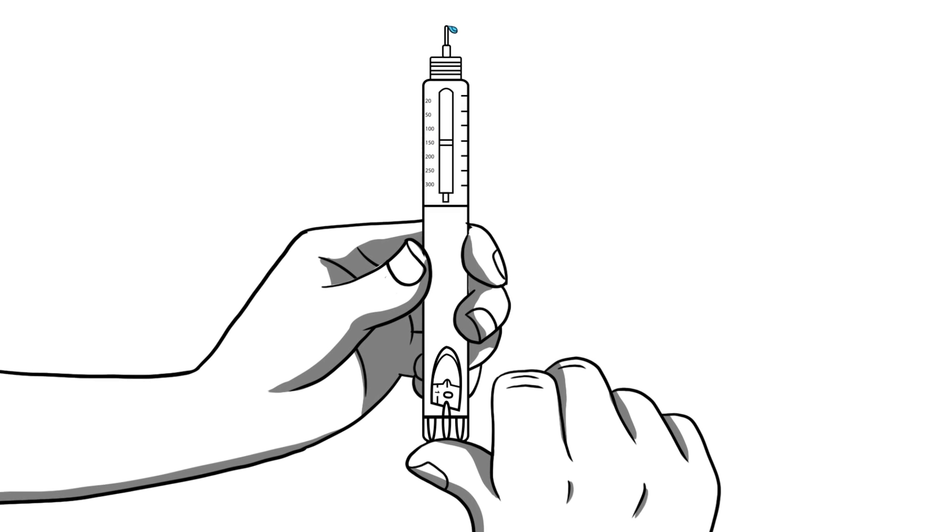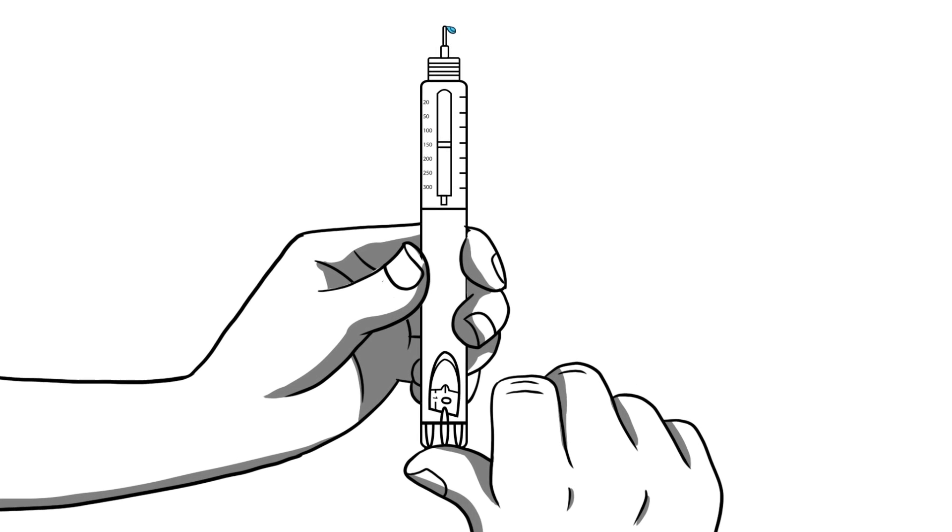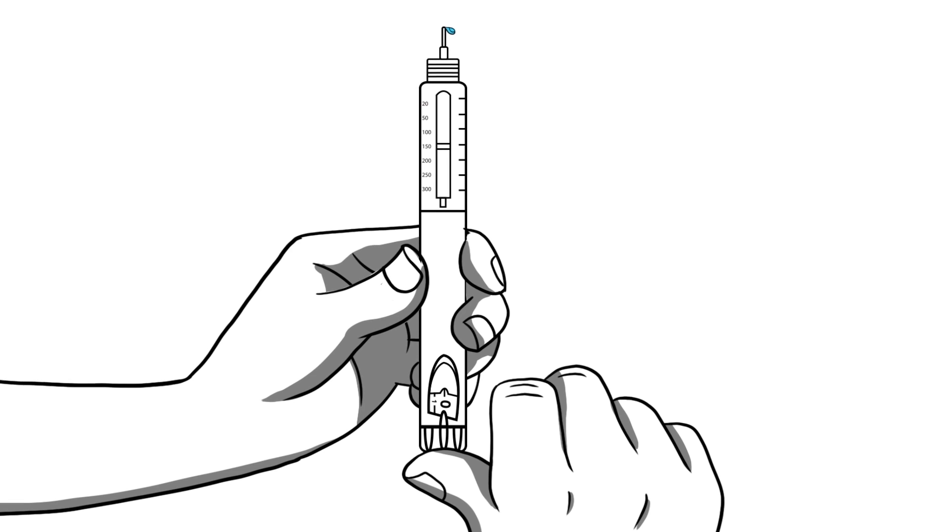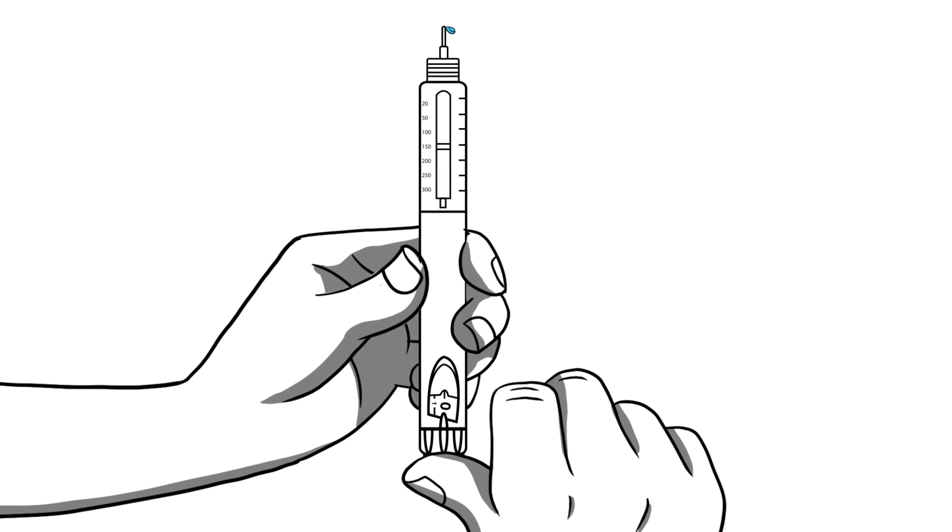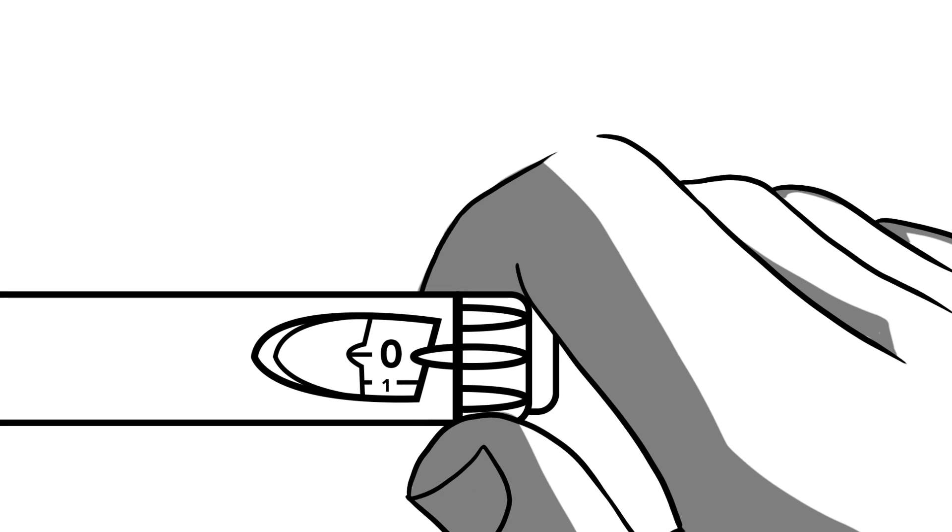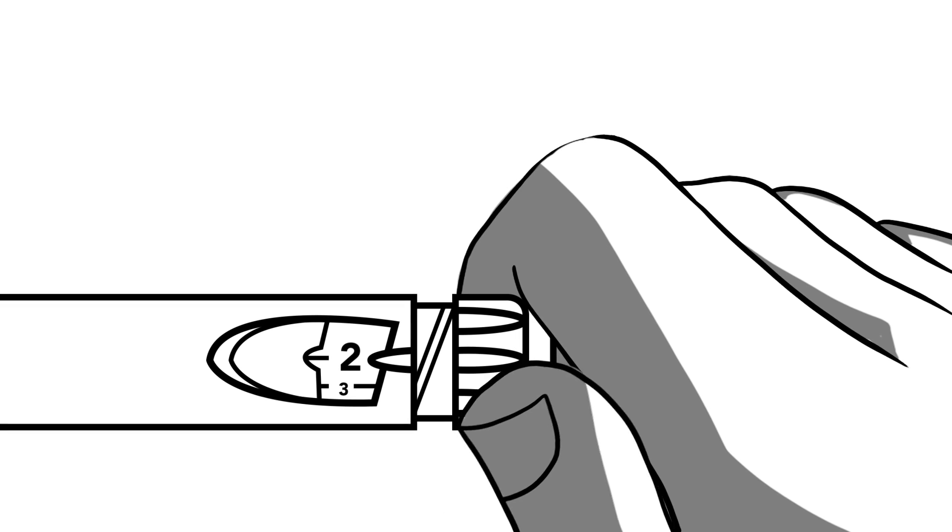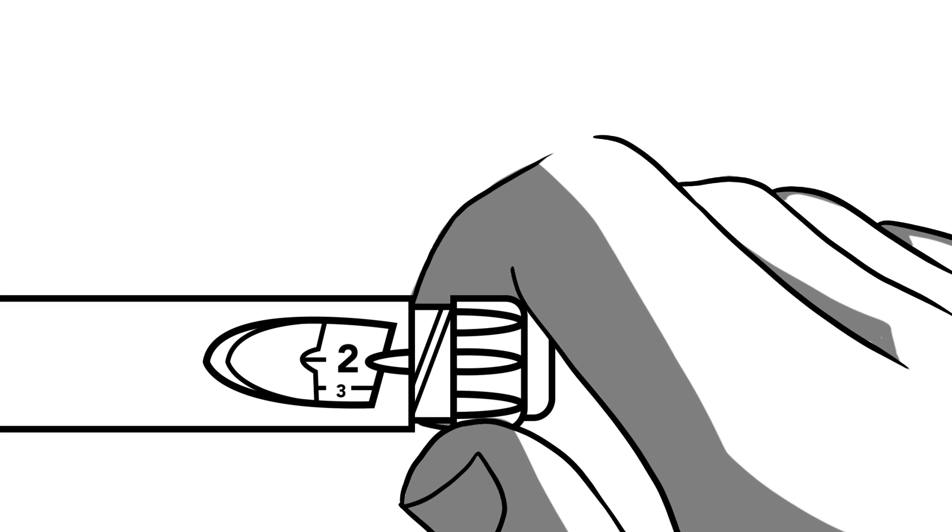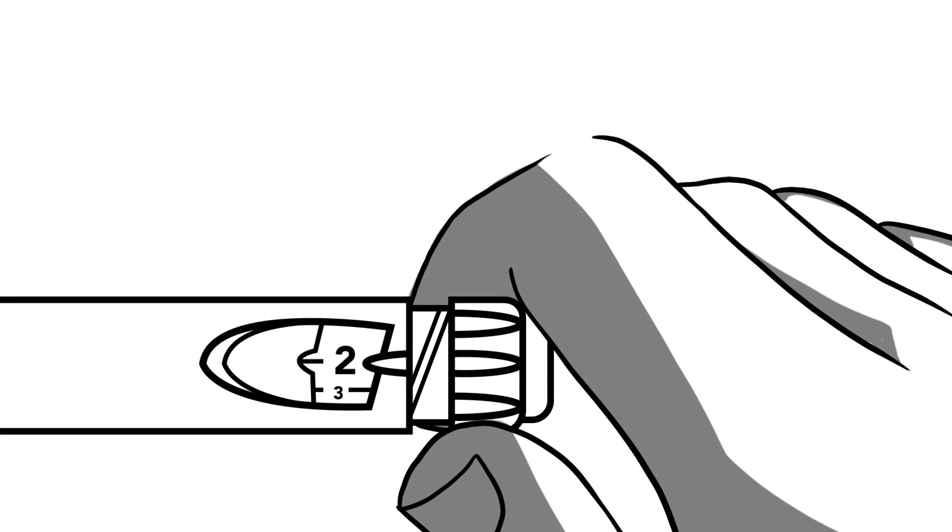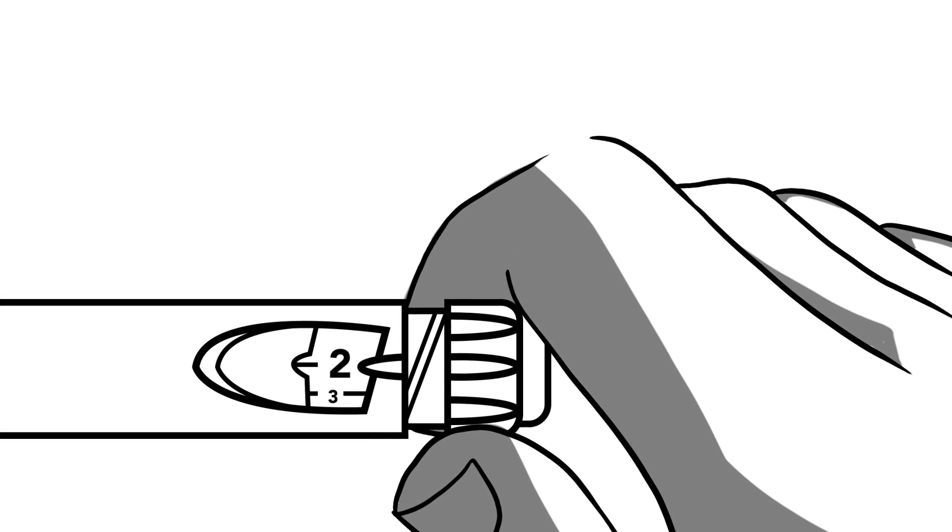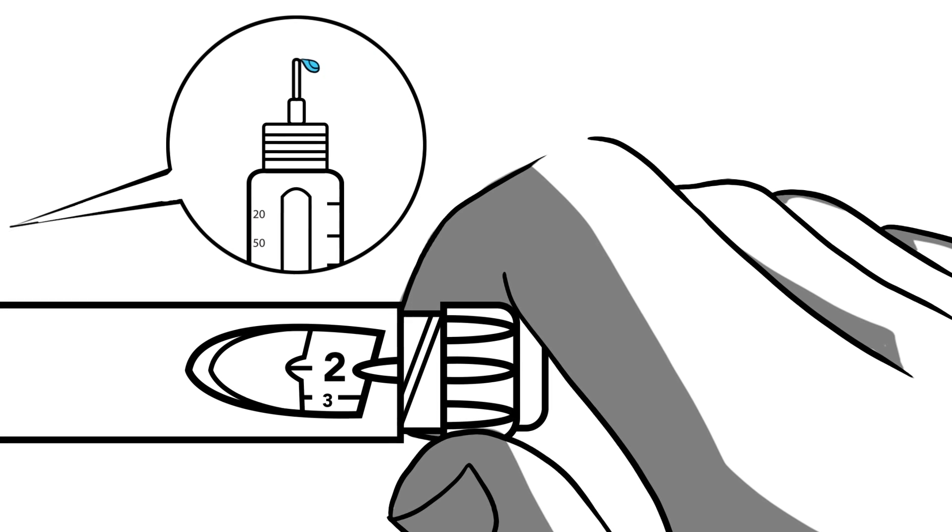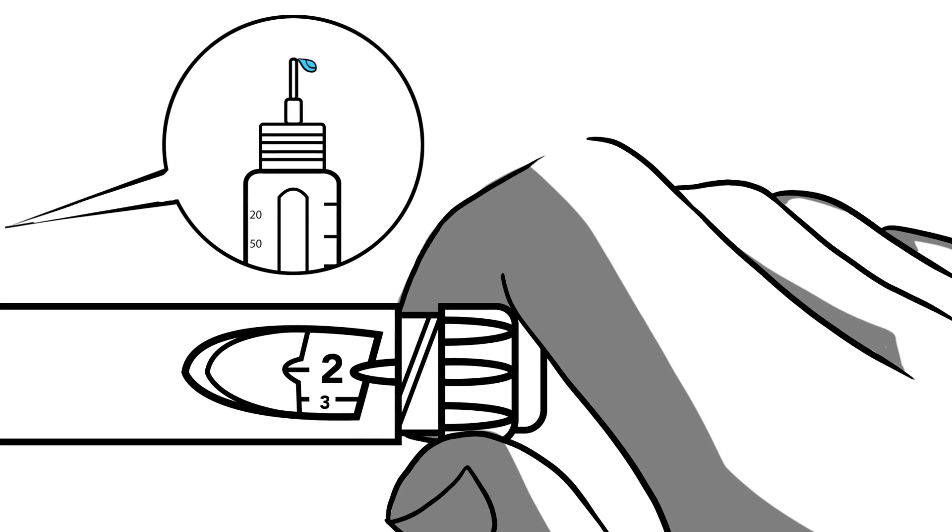A small drop of insulin should be visible on the needle tip after pressing all the way down. If no insulin appears, redial two on the dial and try again. After a small bit of insulin is visible, the pen is ready to use.